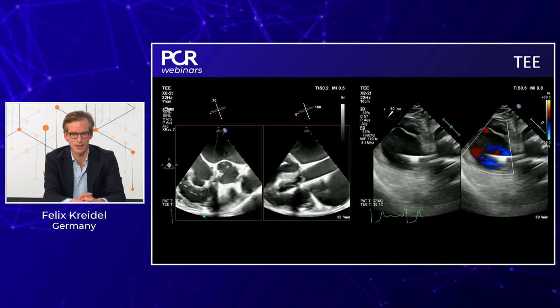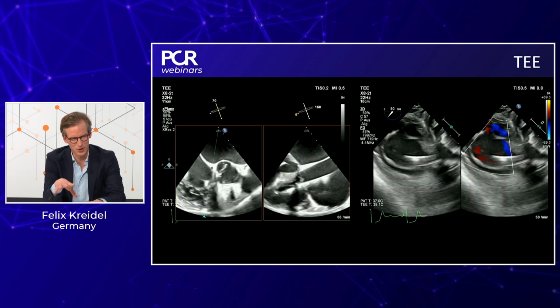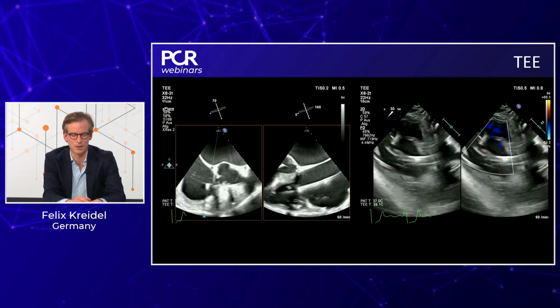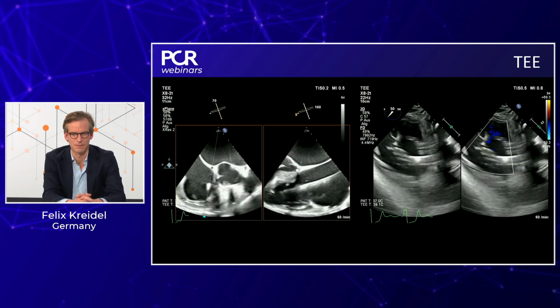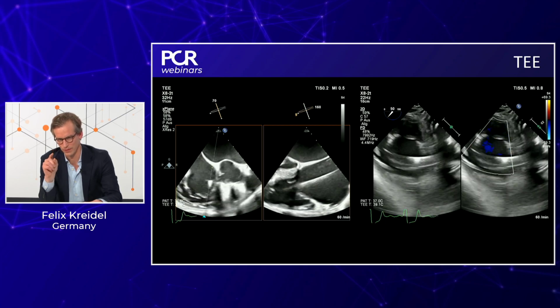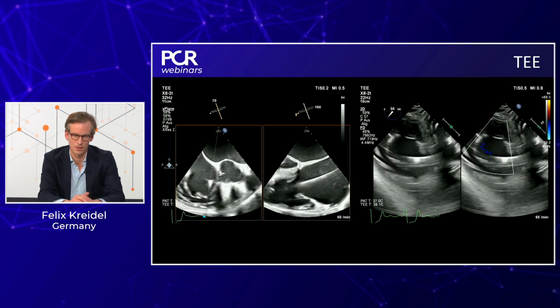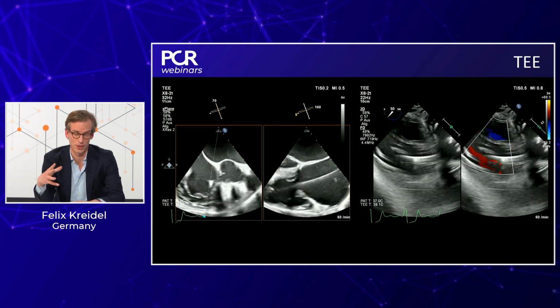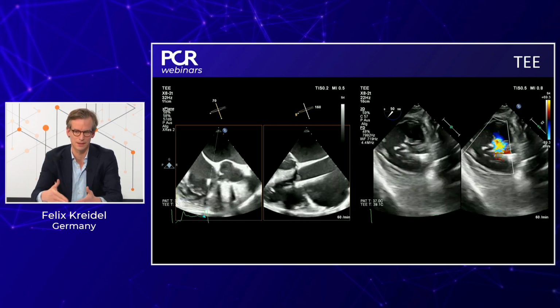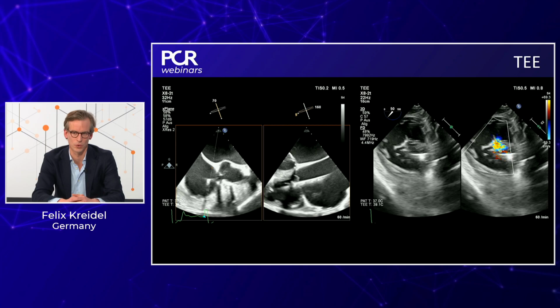Regarding the pacemaker lead, I'm considering that in that unorthodox position, it may have pushed the septal leaflet septally a little bit. This is how I would look at it. Maybe one last point, if we focus on the color Doppler information, we have to appreciate that it's actually not extending from where the lead passes through the valve, but more centrally.